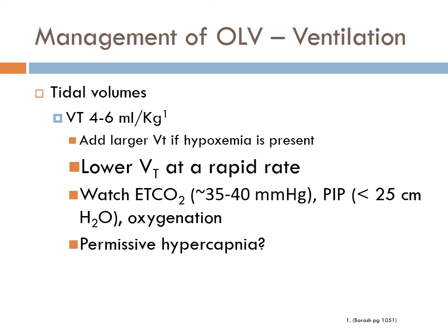So you can achieve that with lower tidal volumes, and this is mostly in animal studies that show this, and it causes less free radicals, less stress. The catch is if you're going to run low tidal volumes like 4 to 6 or maybe just shoot for 6, you want to make sure you run PEEP at the same time. This doesn't work without PEEP. So there might be patients that you don't want to have PEEP on. And then the question of end-tidal CO2 is the next slide. It might be actually good to have a permissive amount of hypercapnia.